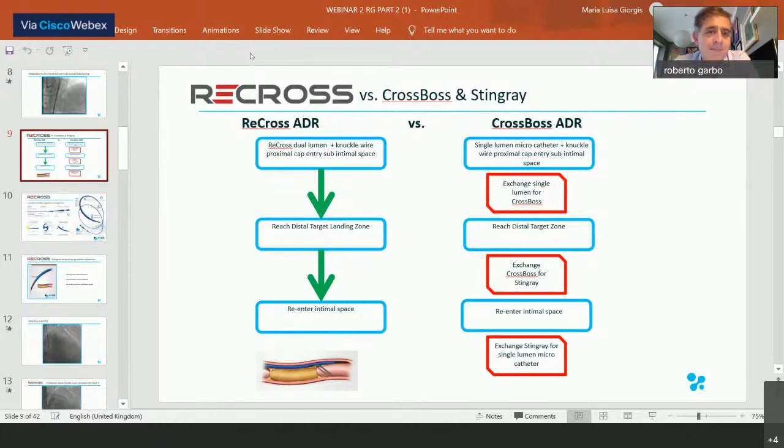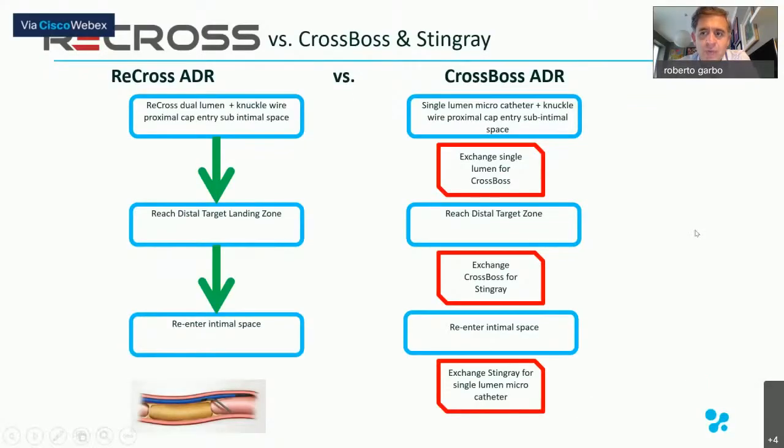So talking about ADR, Gabriele, you can explain this slide on my laptop, which shows the difference between Recross ADR and CrossBoss and Stingray. So please go on if you want.